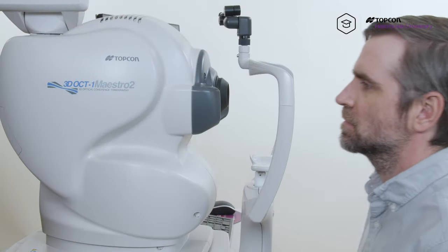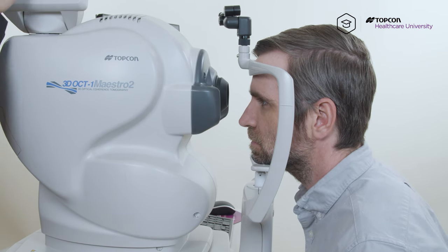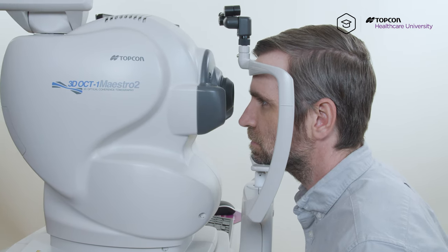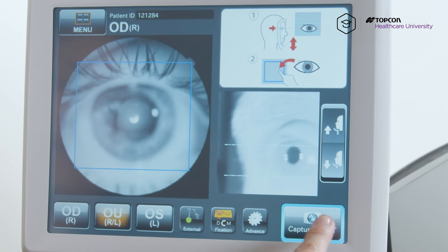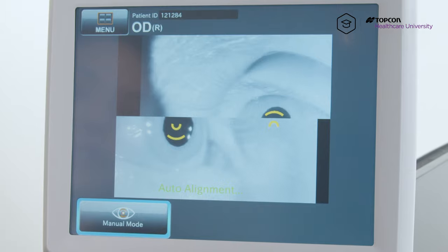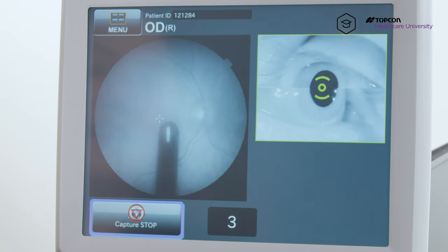Okay, so now I'm gonna have my patient come in forward with his chin on the chin rest and his forehead touching the forehead bar. Perfect. Look straight ahead, center the pupil by tapping it, hit capture start, let the pupils align, and let the patient know to blink normally and to look at that green X.